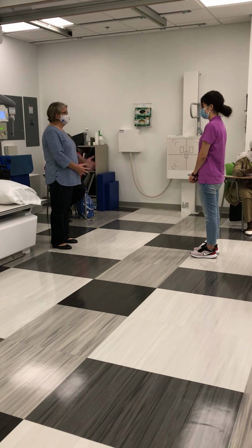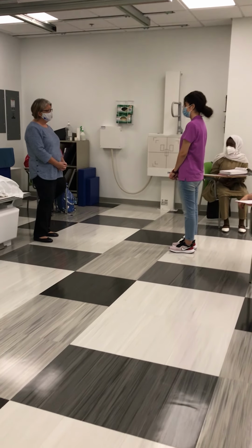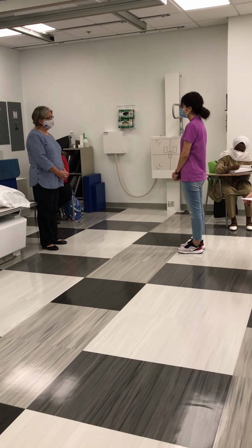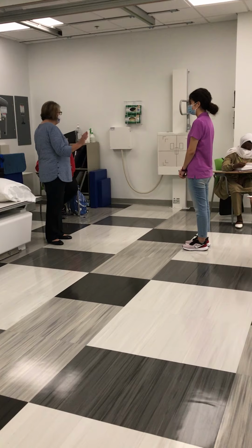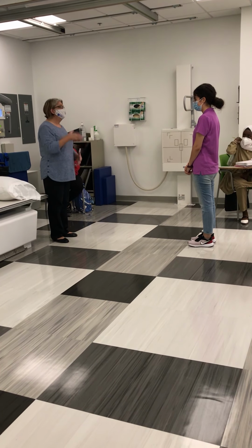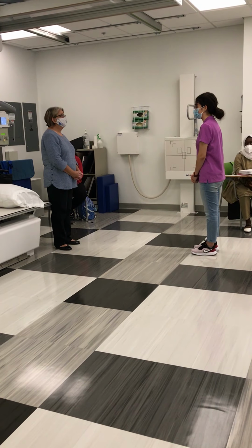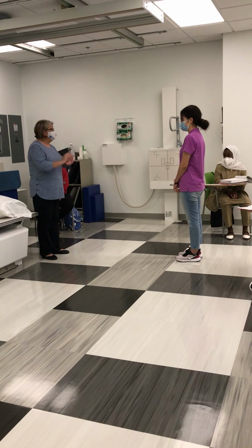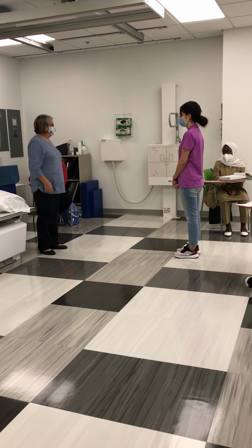I'm going to get a couple of images of your chest today. Can you please tell me your full name? My name is Tuana Albarzinji. And your date of birth. You don't have to say your actual date of birth if you don't want to. It's November 18th, 2001. And is there any chance you could be pregnant? You just say no. Yeah.